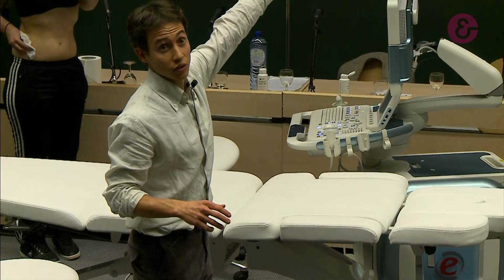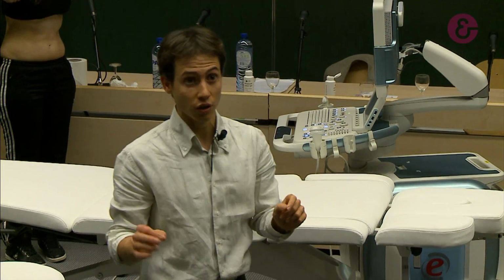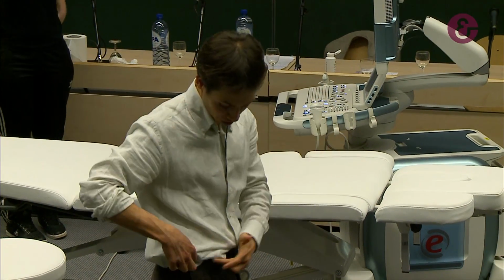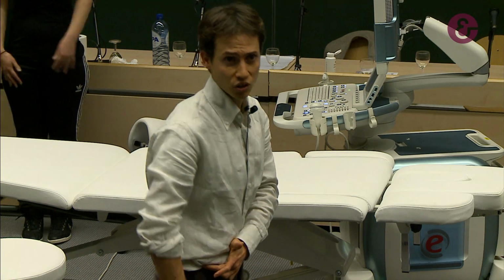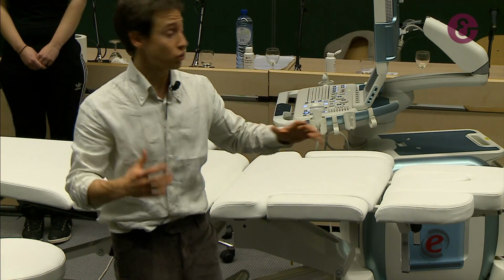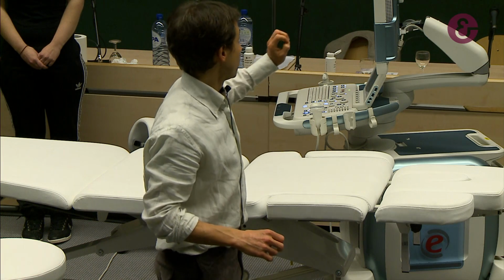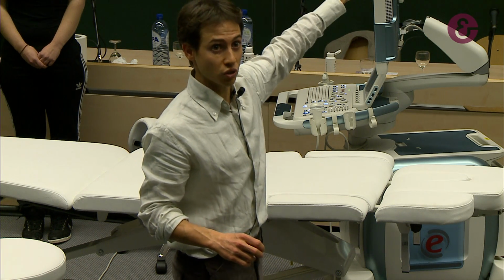I give the feedback on the screen. I explain a little bit what I want. I start using different cues, using these cables. Imagine a cable from here to here, or from here to the hip joint. So I try to use several to see which one could be better. And after I give the feedback to the patient to improve the contraction of this muscle.